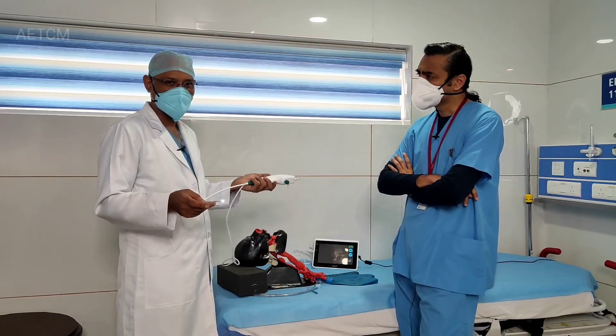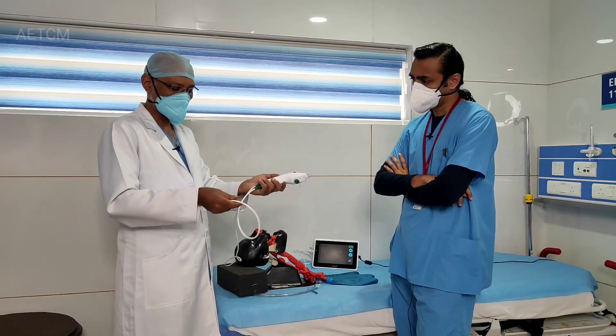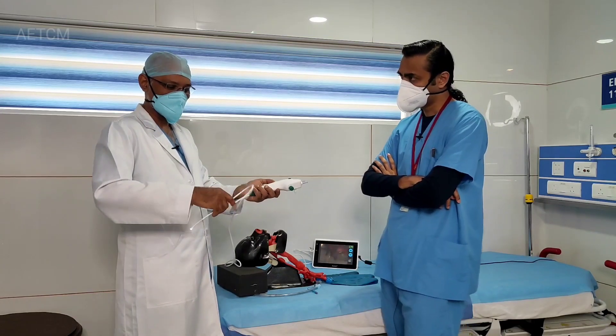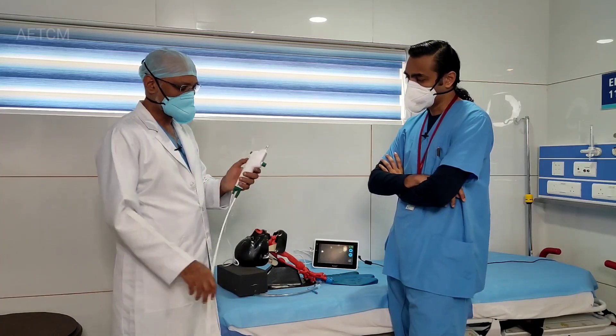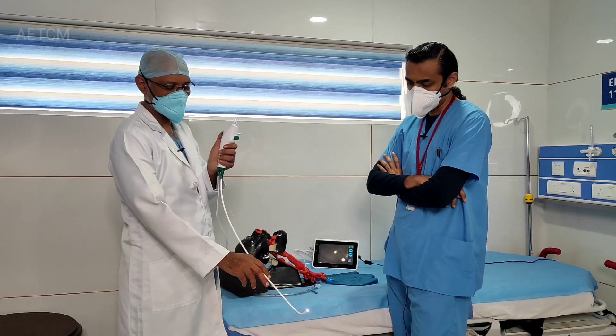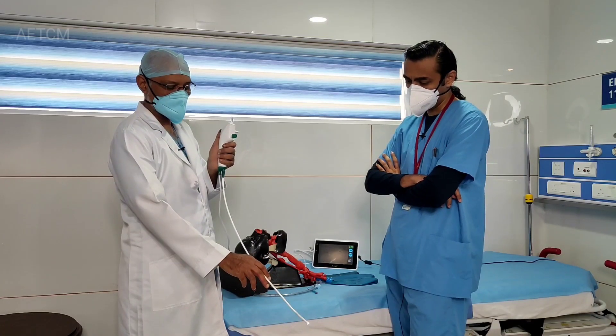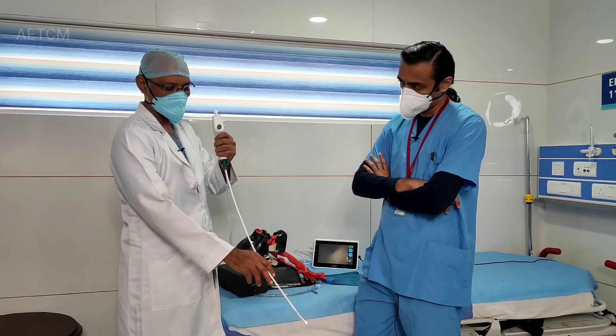There are flexible bronchoscopes with fiber optic. This one doesn't have any fiber optic, so you can actually flex it in any way you want without damaging it. With fiber optic, you don't have that advantage. And then you have a lever here with which you can adjust the tip. The movement is only in two directions, and if you want to maneuver it further, you need to do rotations.